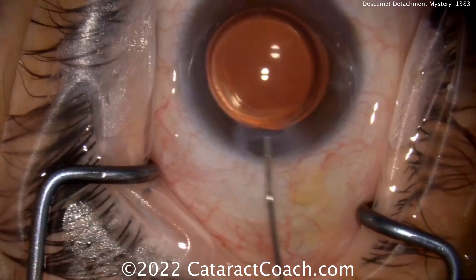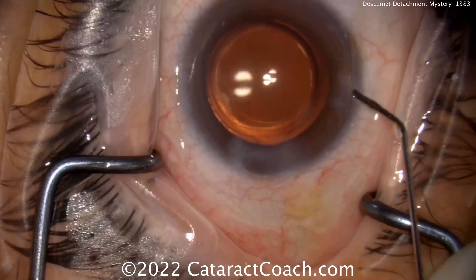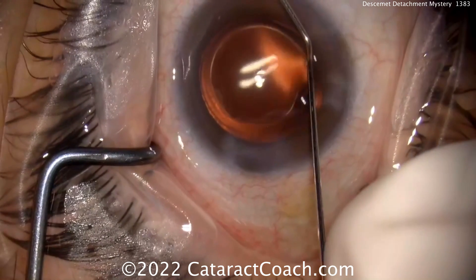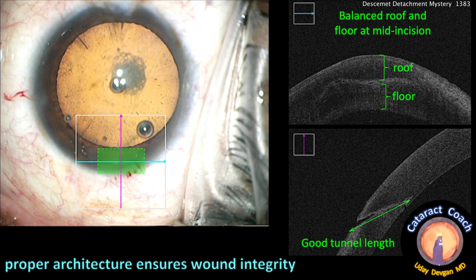So what's going on here? I think it has something to do with the incision architecture — the surgical technique is otherwise pretty good. Ideal incision architecture has the roof and floor of about equal dimensions. Looking at the OCT image at the beginning of the case, the roof and floor are relatively balanced, which is what we want. This is a slight two-plane incision, much like the surgeon who submitted the video, and that does tend to work well. Proper architecture ensures wound integrity — looking here, it's a good tunnel length.